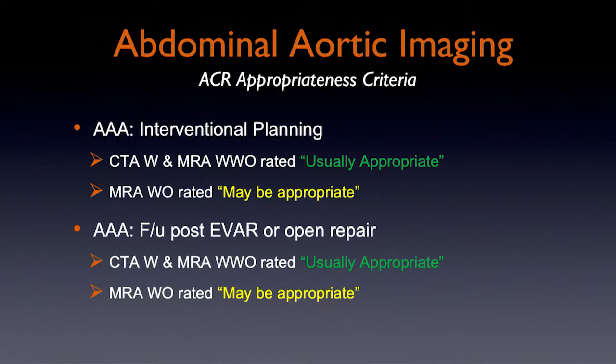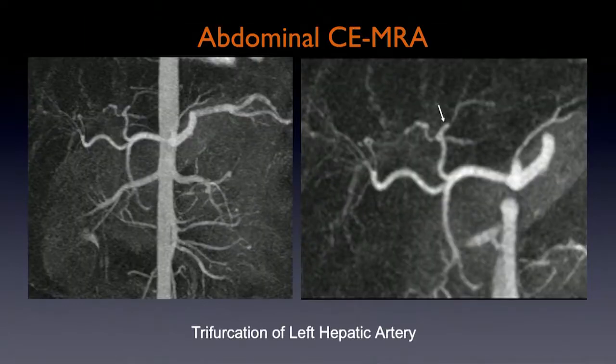So the challenge here is, when would you use one or the other? Is there an advantage potentially with MR angiography over CT angiography in specific settings? Something to consider, and we'll talk about that in a little bit.